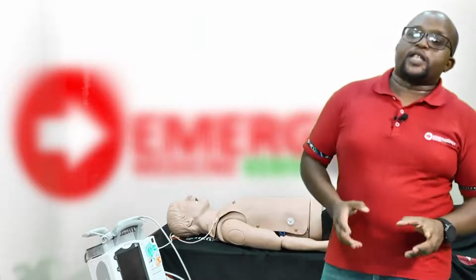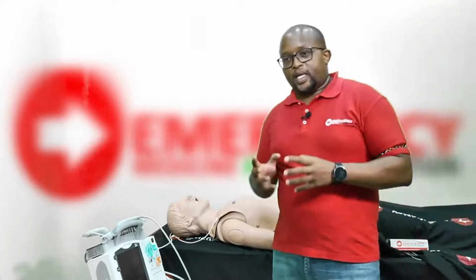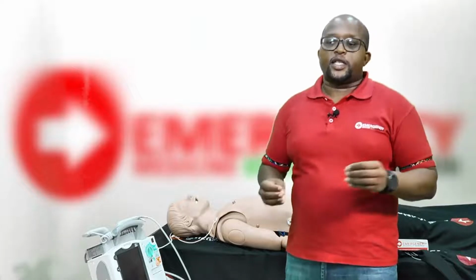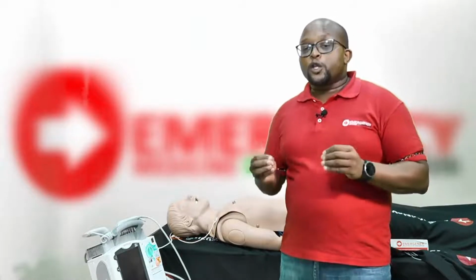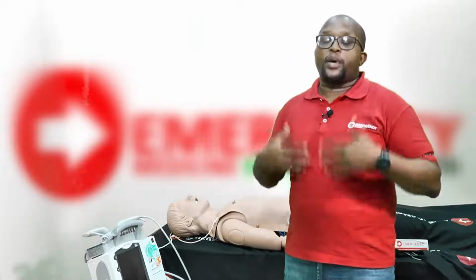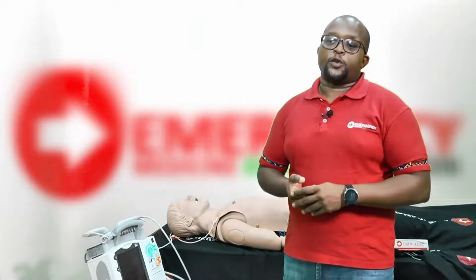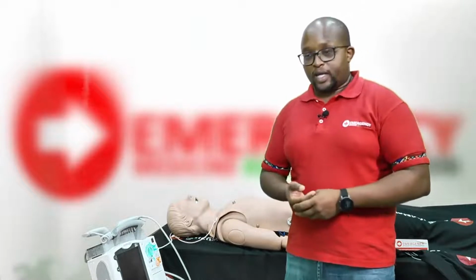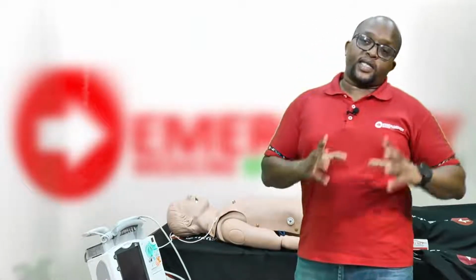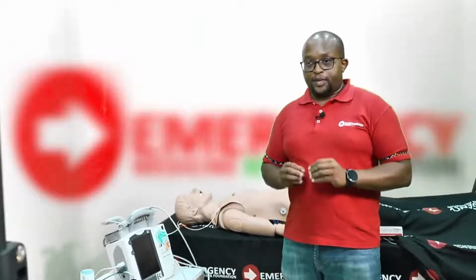Let's discuss defibrillation. What is defibrillation? Defibrillation essentially is passing electricity through a patient's heart to neutralize all electrical activity to allow the heart to pick up and start beating using its own normal sinus rhythm. Now, patients who present with ventricular fibrillation or pulseless ventricular tachycardia need to be defibrillated.